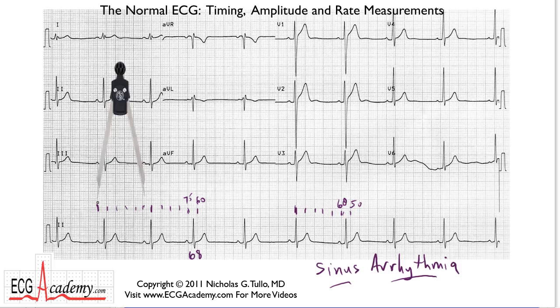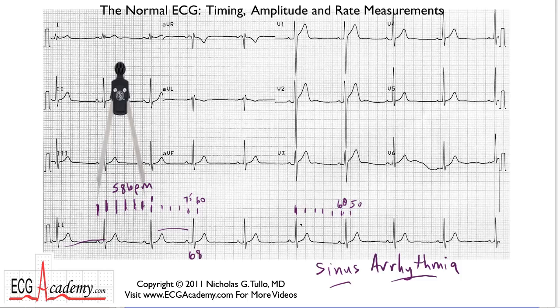In terms of heart rate, you can make gross measurements without counting tiny boxes. Start and count off the numbers: 300, 150, 100, 75, 60 — it's a little less than 60 but nowhere near 50. So again, about 58 beats per minute, abbreviated BPM. This first beat is 58 beats per minute, but there's a normal degree of sinus arrhythmia such that sometimes it's at 68, and sometimes it's down to 55. That is your basic approach to determining heart rate.